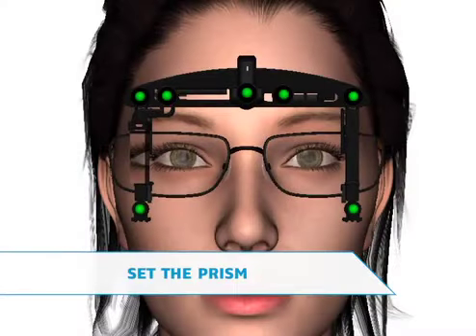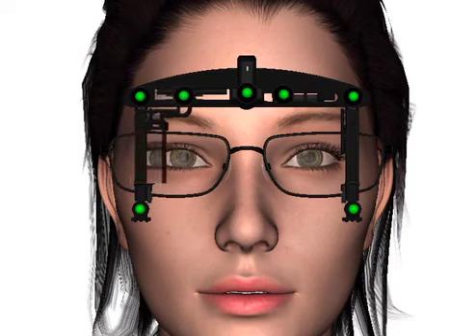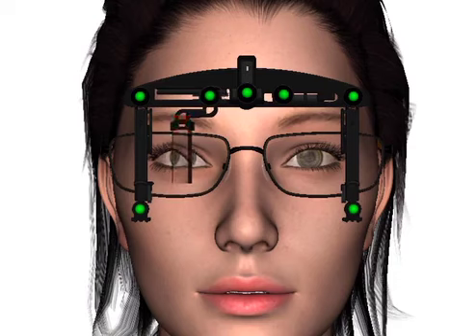The vertex distance prism is horizontally adjusted by applying a light pressure on the prism carrier thumb rest in the desired direction. Slide the prism fully to the left and ask the customer to wear the eyewear in the way they normally would. Align yourself nose to nose with the customer and slide the prism to the right until the pupil is visible inside the prism without obstructing the frontal view of the customer's pupil.